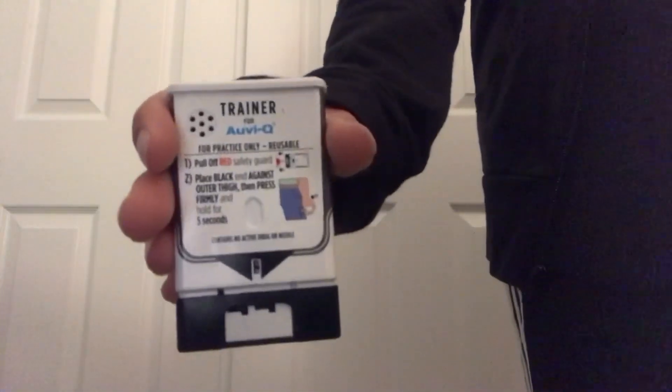As soon as anaphylaxis occurs, you should administer an epinephrine injector and call 911.